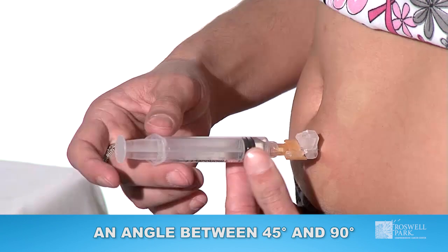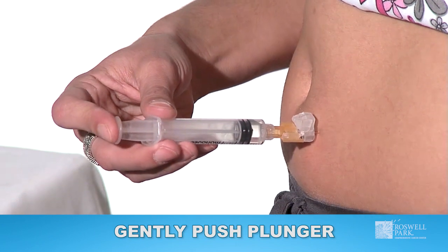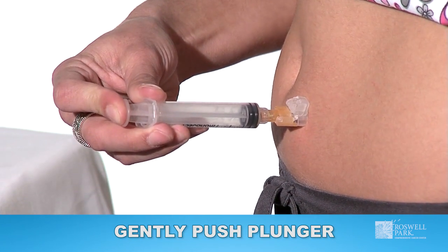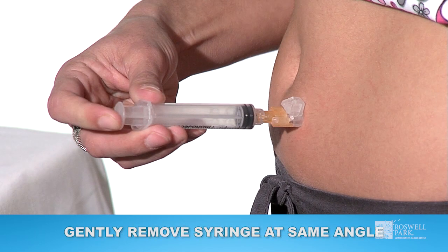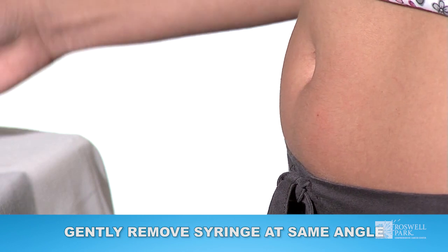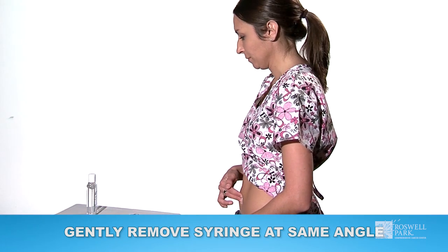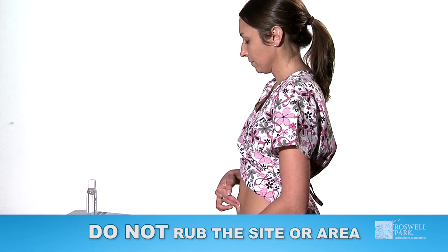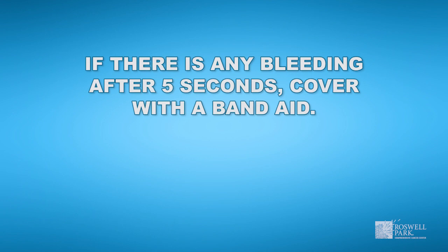Release your skin and begin injecting the medication. Inject the medication by pushing carefully and slowly on the plunger at the end of the syringe. After the medication has been administered, remove the needle gently at the same angle it was inserted. Hold an alcohol pad over the site. Do not rub the area. Check the area for any bleeding or bruising. If there is any bleeding after 5 seconds, cover with a band-aid.